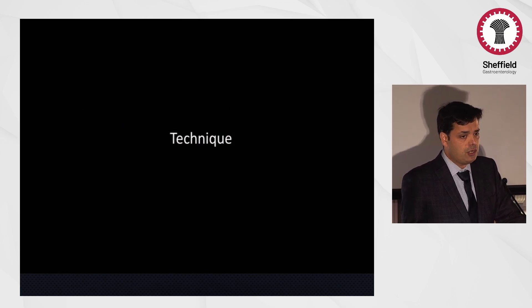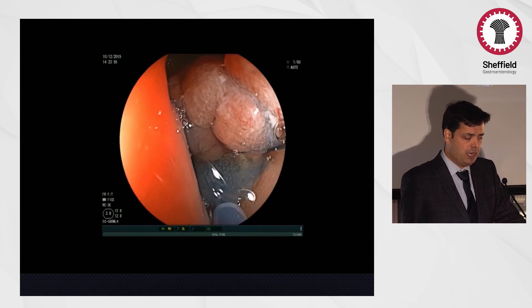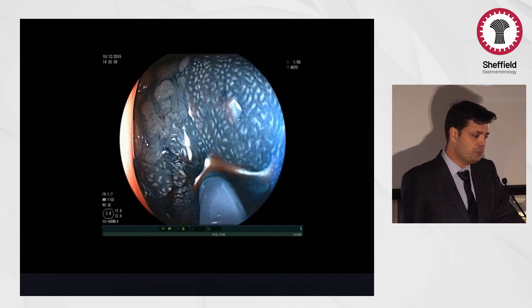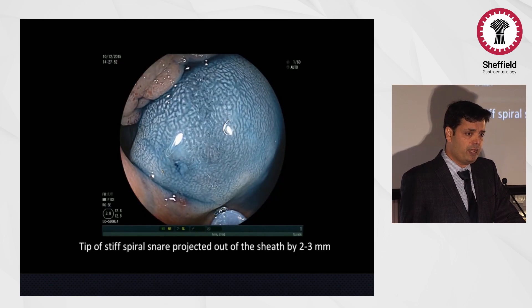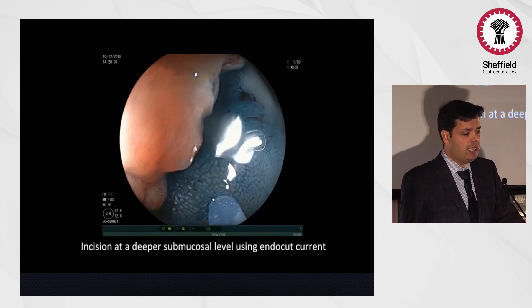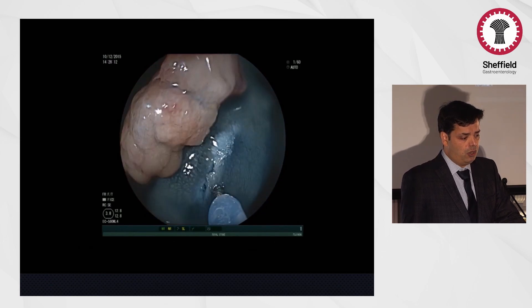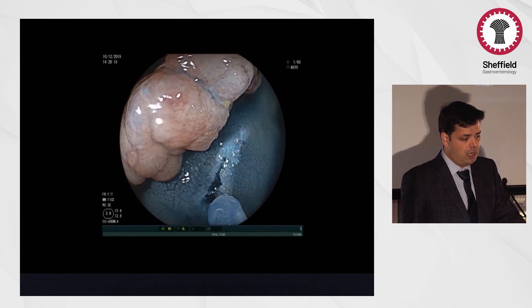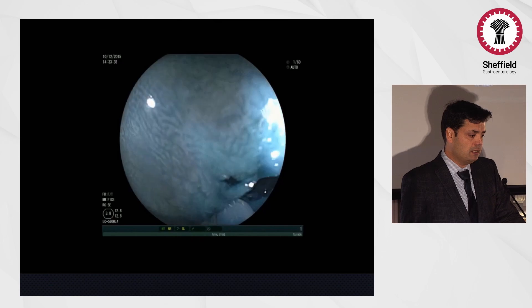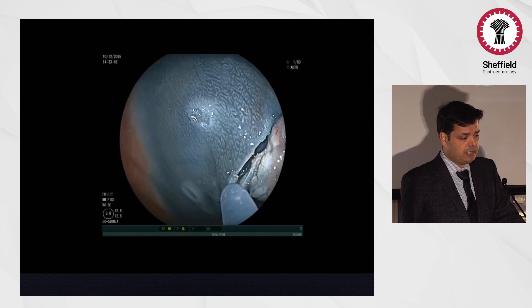I'm going to look at the technique of how we do this. For a suspicious lesion, this technique is used only for lesions less than about two centimeters. The tip of the stiff snare is projected out by two to three millimeters, and an incision is done at a deeper submucosal level, then extended circumferentially around the polyp just like a knife. You then use the snare and engage it in the groove where you've done the incision.